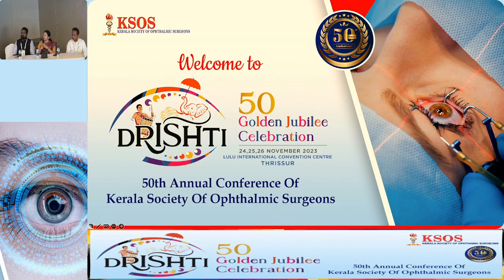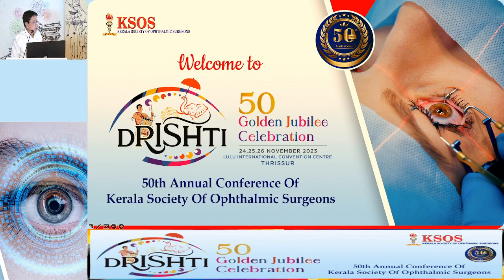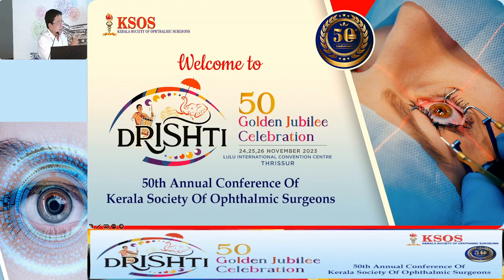No, I had used a femto in that case. That's why you could see the border of the rhexis in the rest of the place. But the thick fibrotic patch, it doesn't do anything to it. So that's why I had to. But it gives you a nice template for the rhexis, and so you get an almost rounded rhexis. But that area you have to cut with the scissors only.